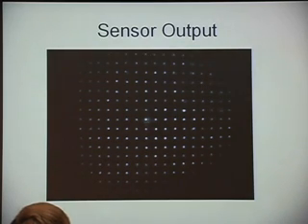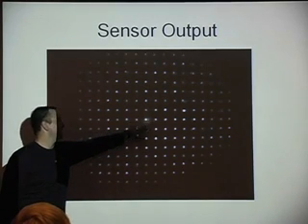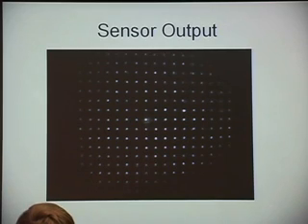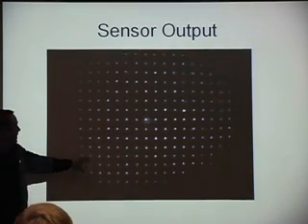This reflection here, what you're actually seeing, this bright spot here, is what they call the Purkinje reflex. We're putting in that laser near the center of the eye. Some of the light is bouncing right off of the normal portion of the cornea. So you can look and say, okay, this is actually the highest point in the cornea right there.